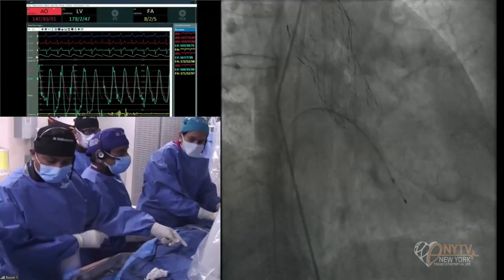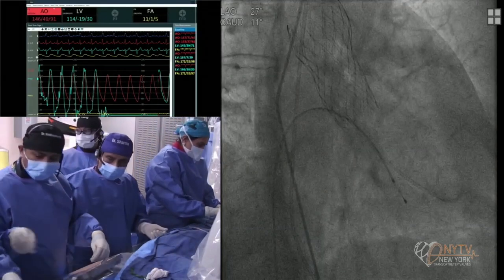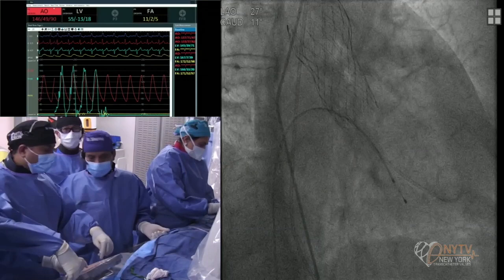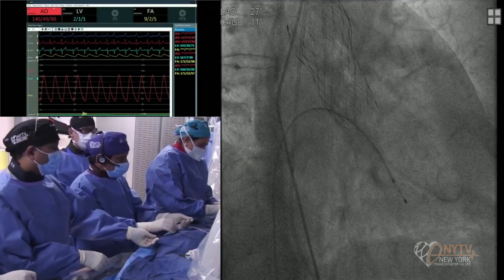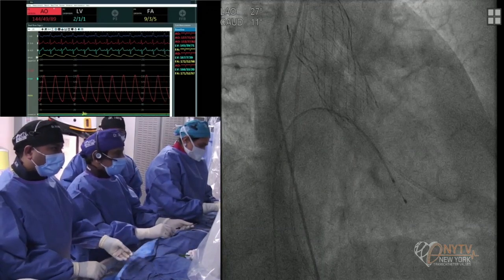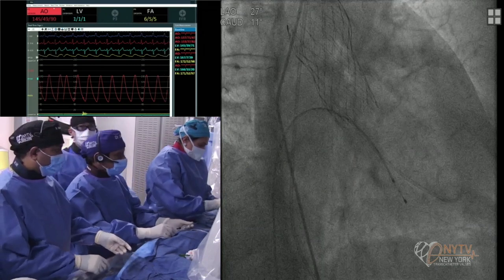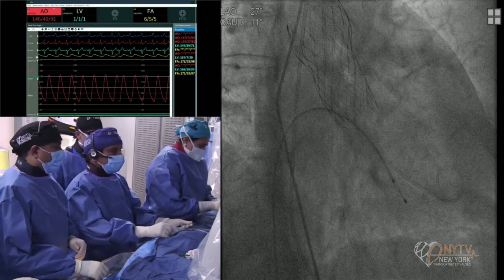You saw, right, Howie? Be careful, make sure the systolic pressure is low. Because remember, this is a mechanism AS-AR. We fixed the AR, okay? And the AS obviously has also been fixed. Now, there's some residual PVL. I mean, definitely it's better than baseline. So clinically, the patient should not feel a difference with this kind of AR. But if you want perfection, you can do that.